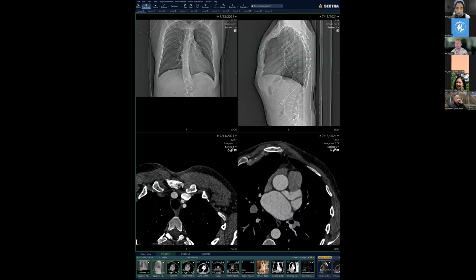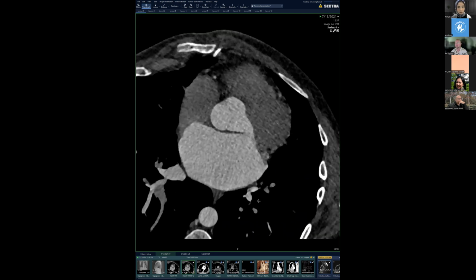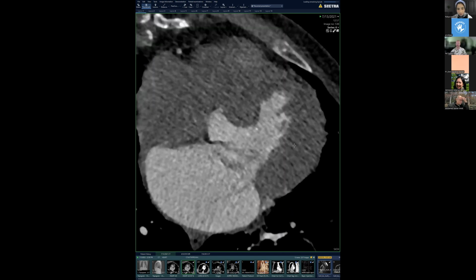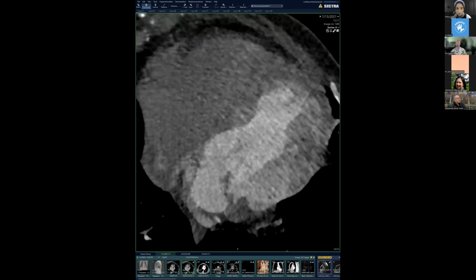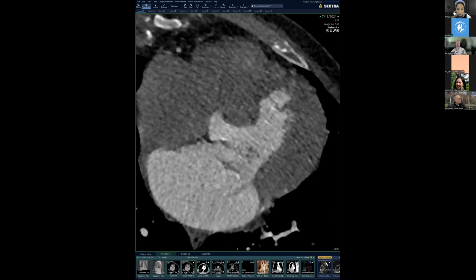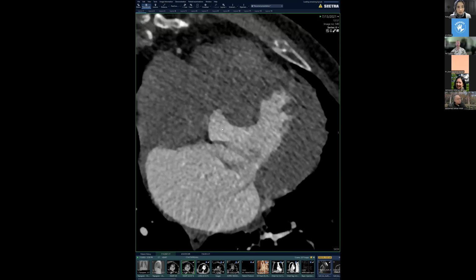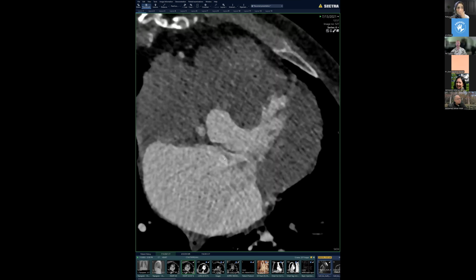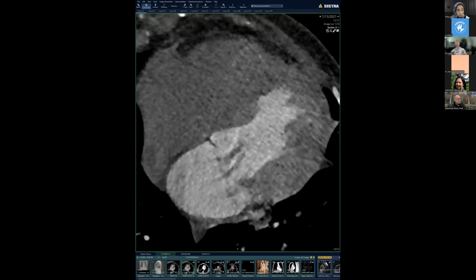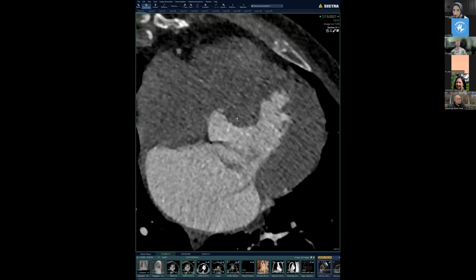we shall go and look at this heart a little bit closer up. And the astute observers already are probably observing that there's something really wrong with this mitral valve. Granted that there is some motion artifact as well. But even on the axial view, if we use the same anatomic landmarks right here and right over here, we can see that some of the leaflet portions are extending above this line. So we see that this patient also is going to have mitral valve prolapse. You also have some leaflet thickening and apparently some redundancy. And we have a fairly large left atrium.